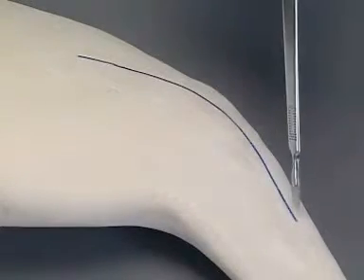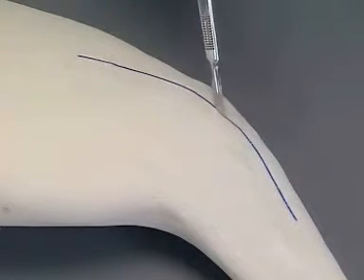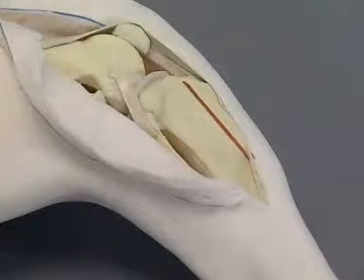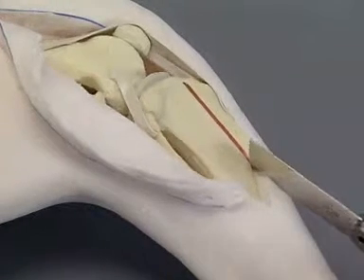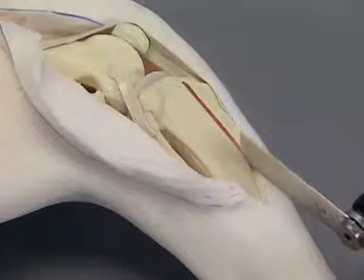The fascia is incised on the cranial lateral aspect of the stifle. The fascia is retracted to expose the distal one-third of the femur and the proximal one-third of the tibia. The tibial crest is osteotomized to aid exposure of the joint and to prepare a surface for the plate.